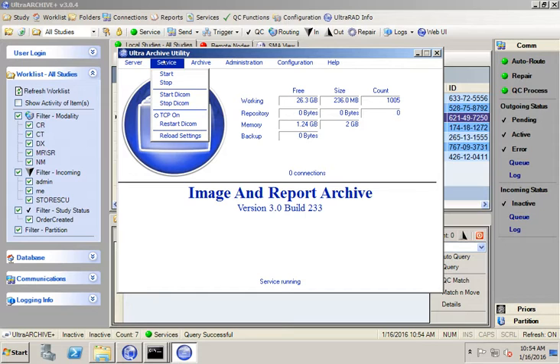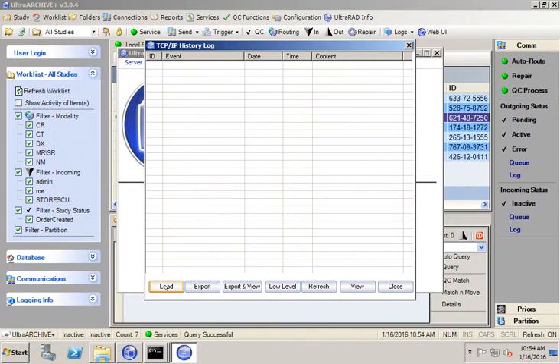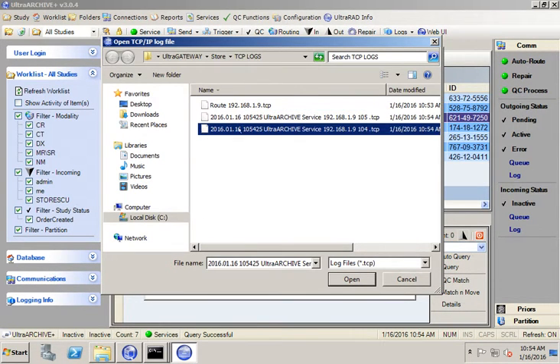So I've enabled the debug logging, but it's not yet writing a log file. Before it begins writing TCP log, we have to click Restart DICOM. Once you click Restart DICOM, you'll be able to send a study, and it should log it to the TCP log. Let's take a look at the TCP log first. I'm going to click on Server, Logs, TCP IP log. Then I'm going to click Load, and I have to find the correct file.